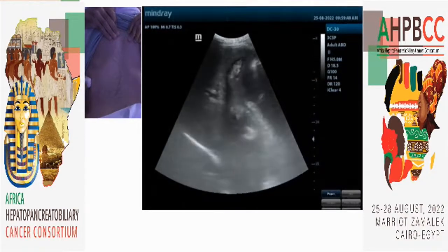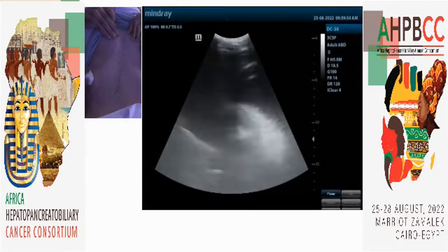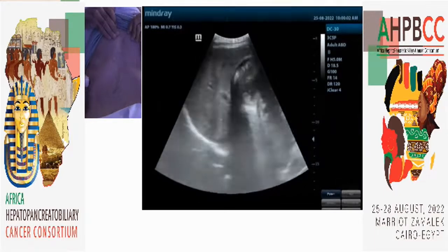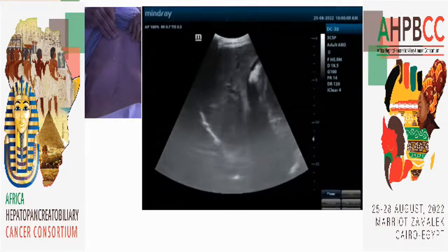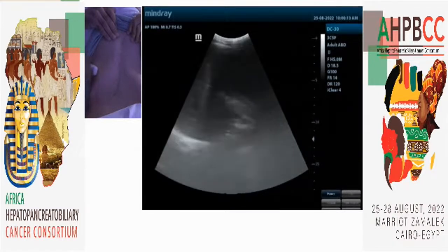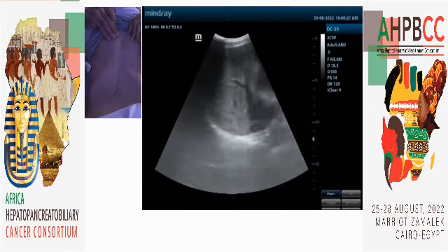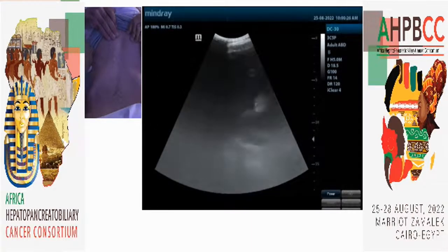I can see his gallbladder. Oh, is that another gallbladder? It is, yeah. It's contracted and contains sludge. Okay. So, I'll go to the next intercostal space, which is where I am now, still in station 4, and then sweeping through gradually.